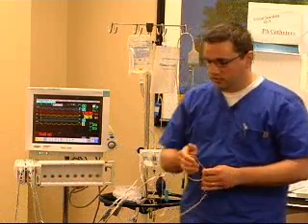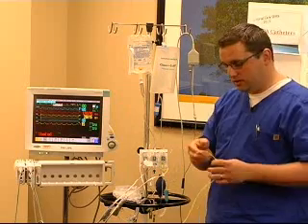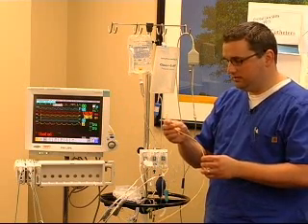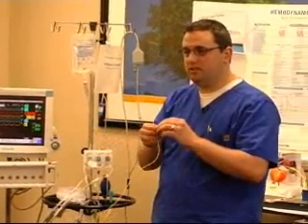Okay? So now they have this end, and they're going to ask you to do a couple of things. They're going to ask you to check your balloon, make sure that it's going to work, and it does. And you notice that when she got done, she didn't pull back on the syringe; she passively let it deflate. The balloon will naturally push the air back out. If you pull on it, it can weaken the balloon and cause it to rupture.